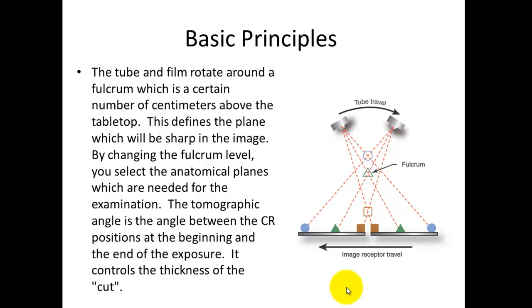Well, at least sharper, because as you'll see, as we did on the last couple slides, some of these images seem like they're blurry. The reality is you cannot get that sharp of an image in traditional radiography, at least not until we have gotten into computed tomography or CAT scan.